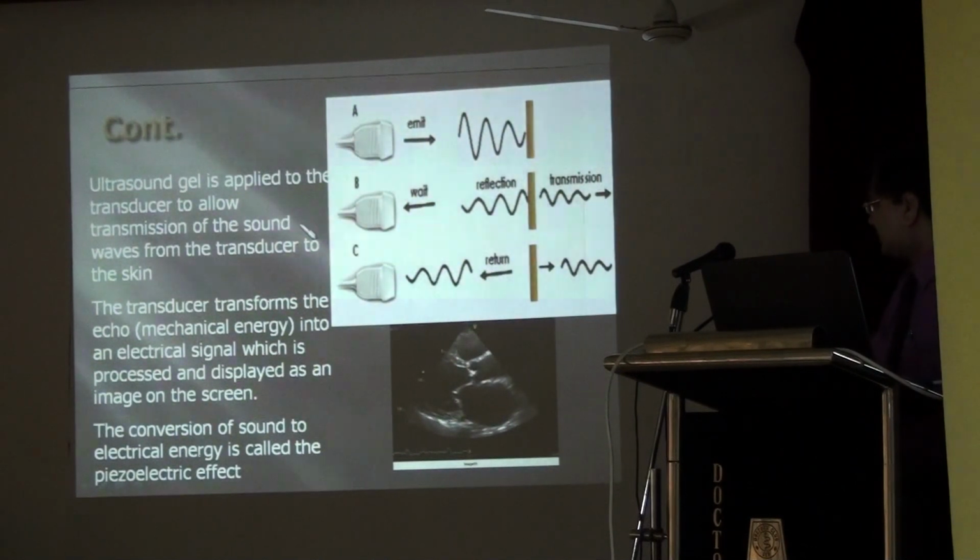So what is the basic physiology here? The transducer converts mechanical energy into electrical signals, which are displayed, and gradually the sound is converted to electrical energy. This effect is known in physics as the piezoelectric effect. So this is the basic principle for echocardiography and its interpretation.